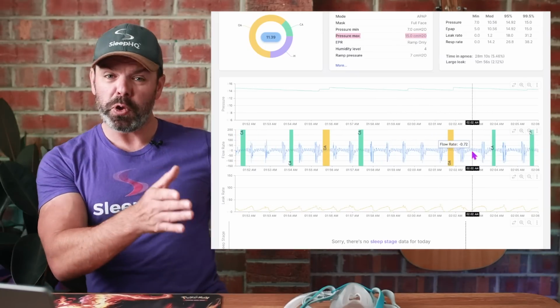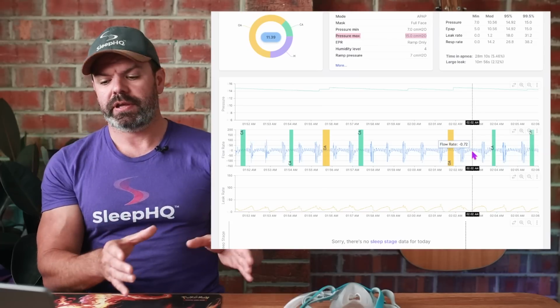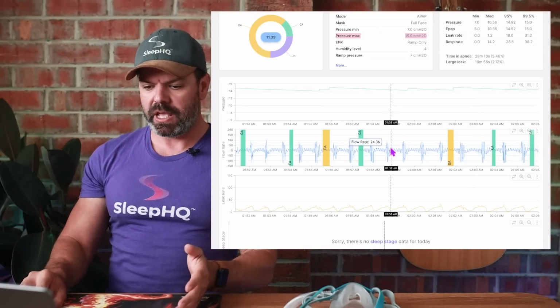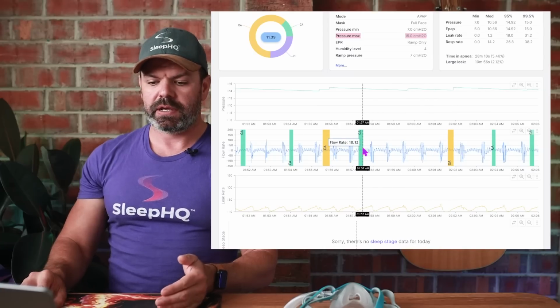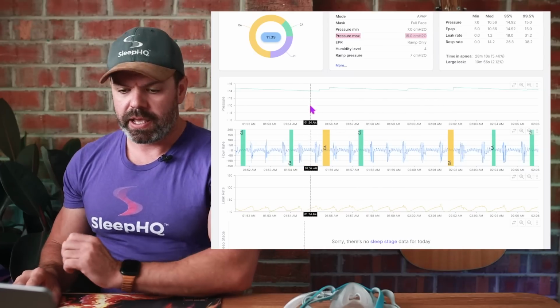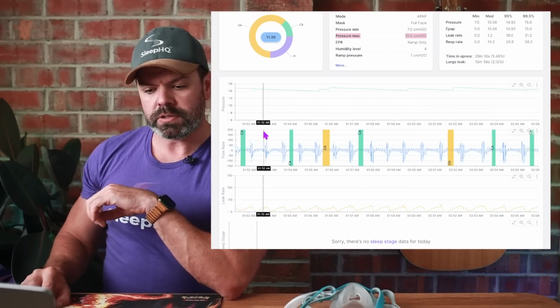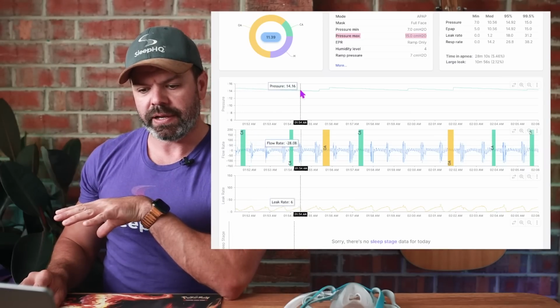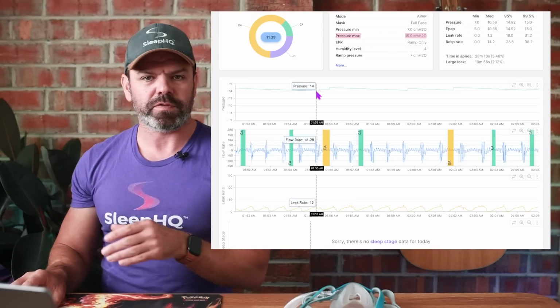So in the beginning it was perfect, nice and accurate, and now all of a sudden, not so accurate. Look how many flags have been missed. And we've also got these green central flags. And now look at the pressure as well. Because the flags aren't accurately marked, the pressure here is dropping down. It's gone from 15 down to 14.